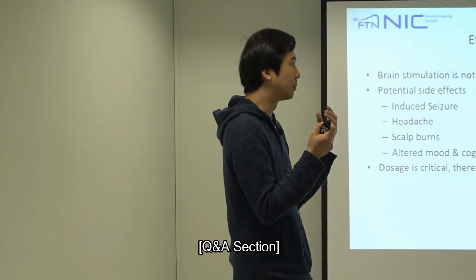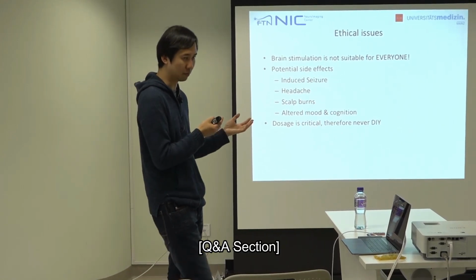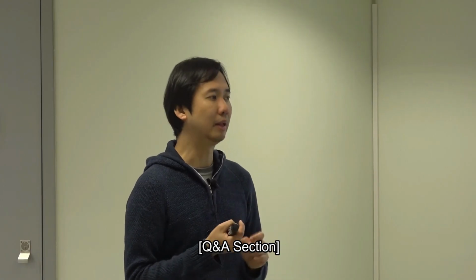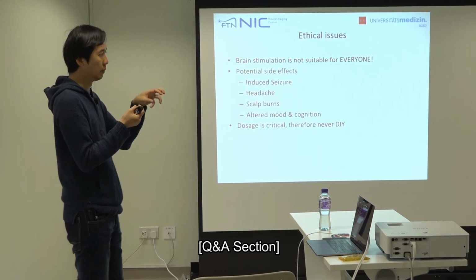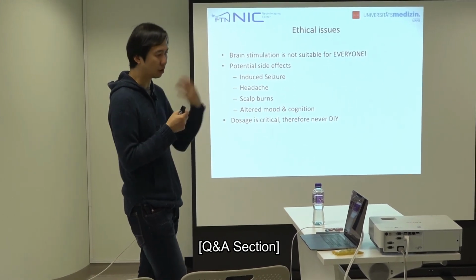TDCS usually, I've tried once myself. Just at the very beginning, you will feel a little bit of tingling sensation, but during the stimulation, you won't feel anything. So it's relatively easier for people to accept it, or you could say to come back again if you want to do multiple sessions of experiments with them. But then the downside of TES is that the area of stimulation is not that precise. Also, if the target location is not at the gyral site, but in the sulcal site, it's more difficult to stimulate. Although there are more advanced techniques that you could try to overcome these issues, it takes some time for you to master the technique in order to get good results.